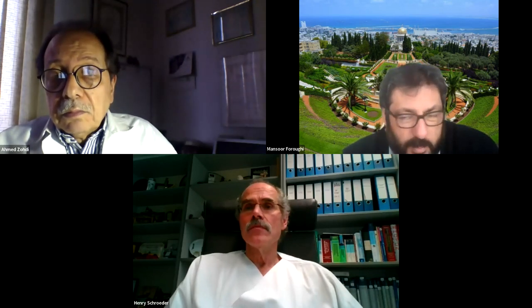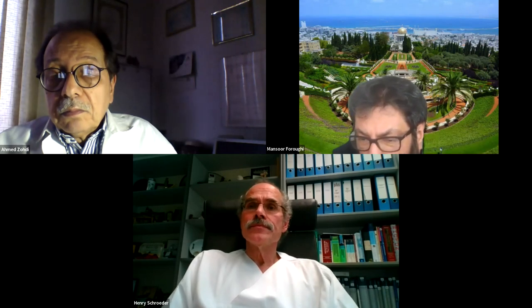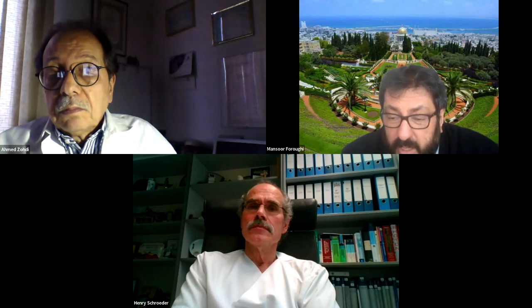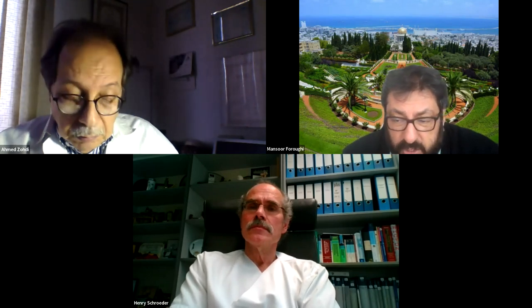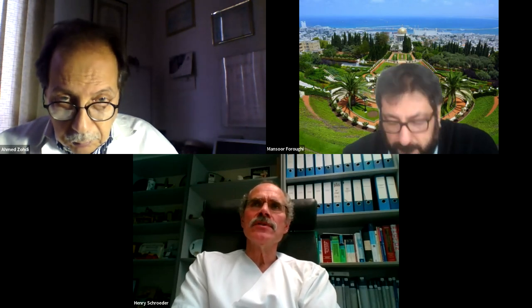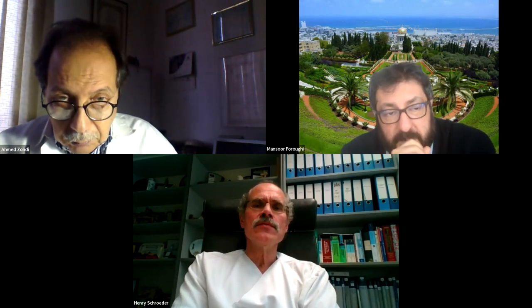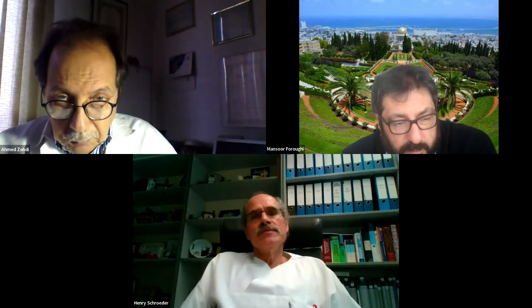A question to both of you. One of the audience has asked, how do we follow the integrity of the stoma in ETV, both post-operative radiology and clinically? Do you want to add anything to that? We do the CISS sequence and the inversion recovery turbo spin echo, there you see the flow void. Initially, we did cine MRI, but this is not absolutely required. I like to have this black signal, and it's very nicely seen with the inversion recovery turbo spin echo sequence. And then we have the CISS where you see the stoma size. That is what we do.